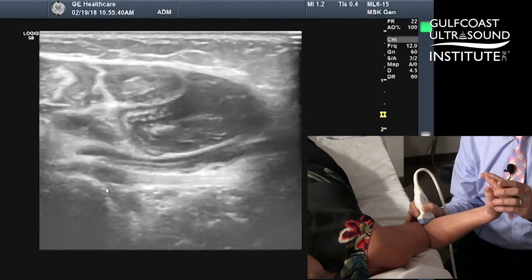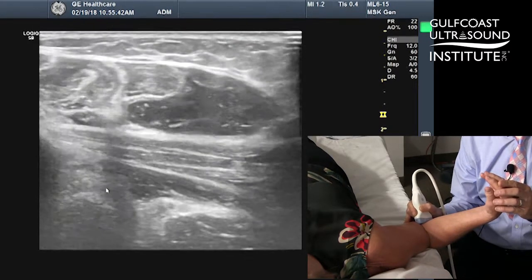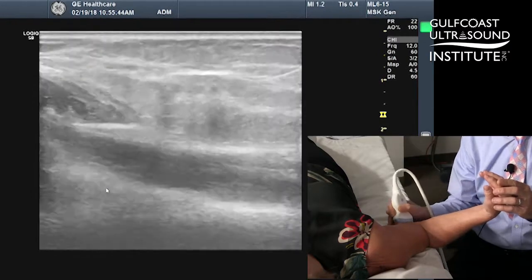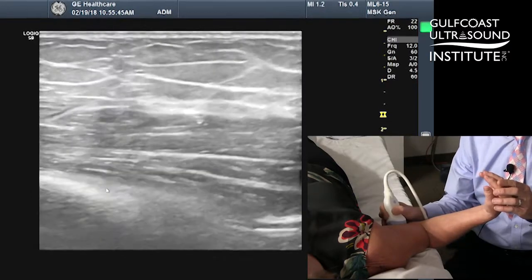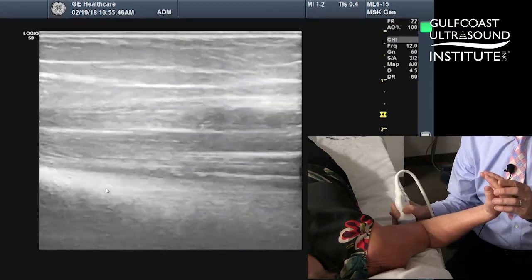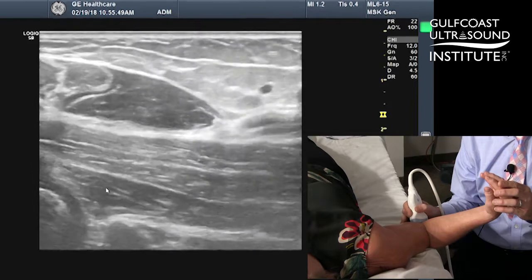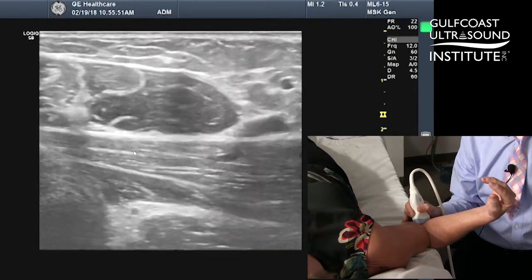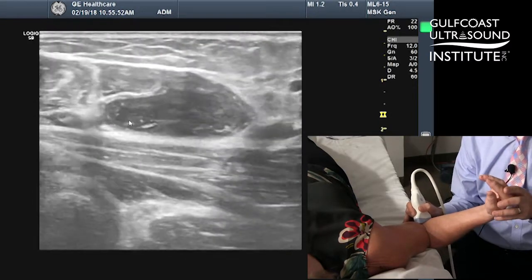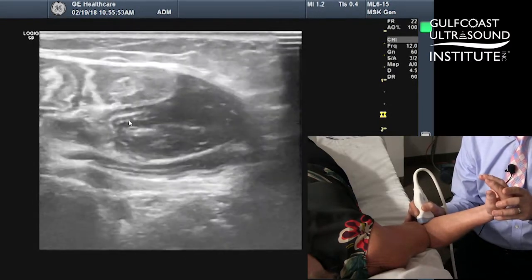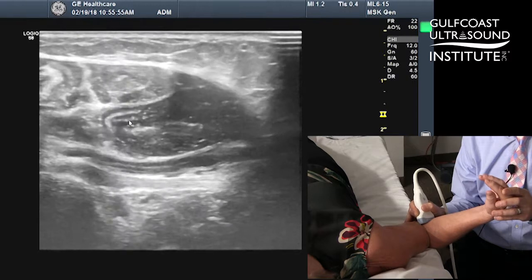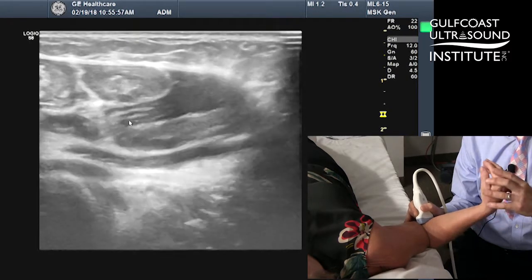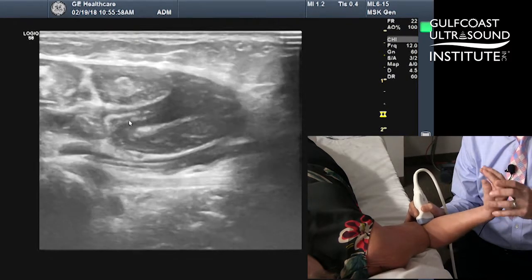So this is the pronator window, the approach that I use. Just to review: you want to start on the medial humerus, slide down distally, come anteriorly, until you see the cross-sectional view of the pronator. And then once you see the artery, look just beyond that, and you should see the nice biceps tendon in long axis.